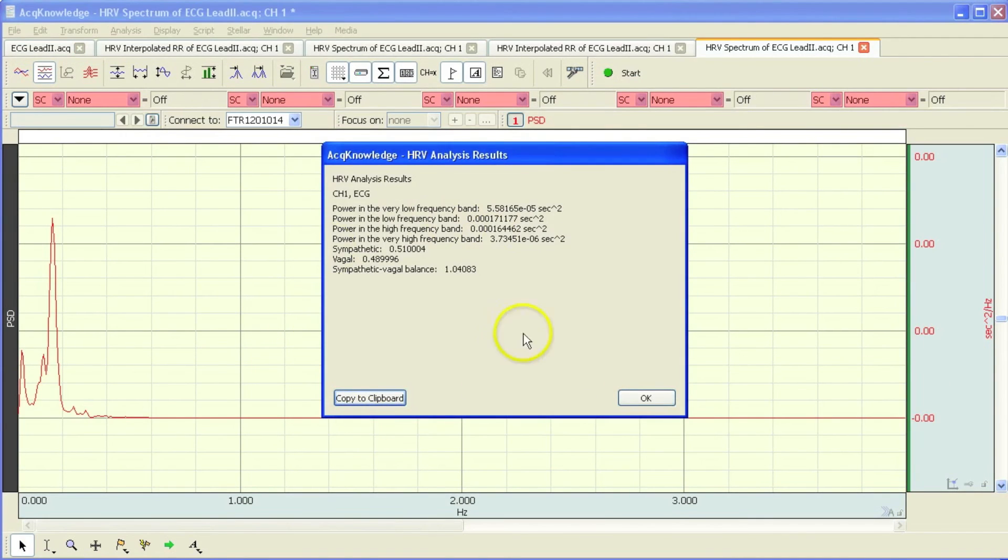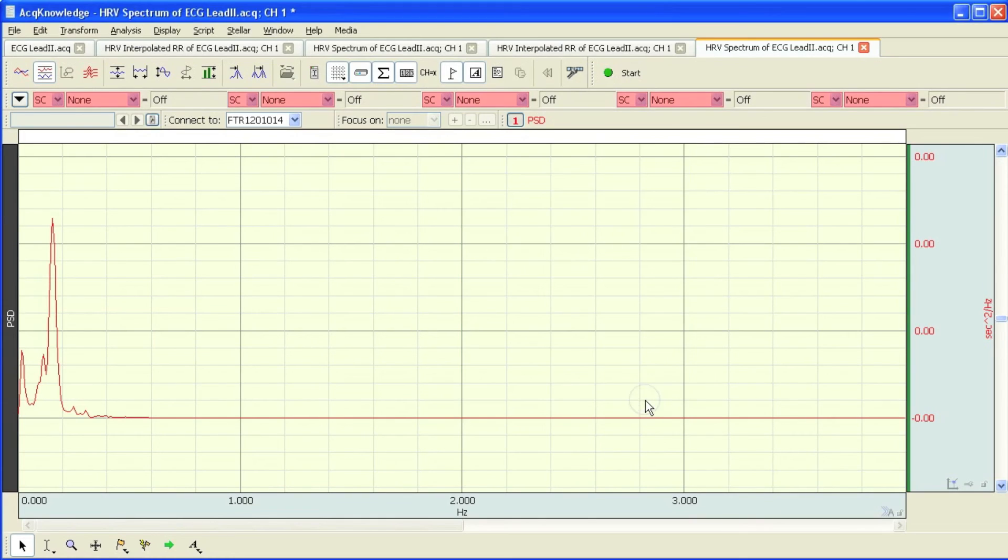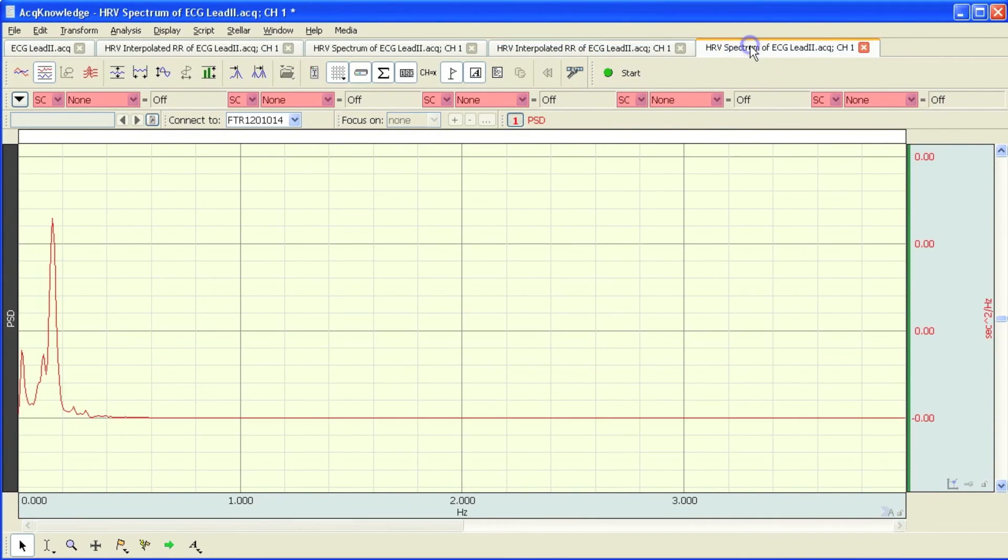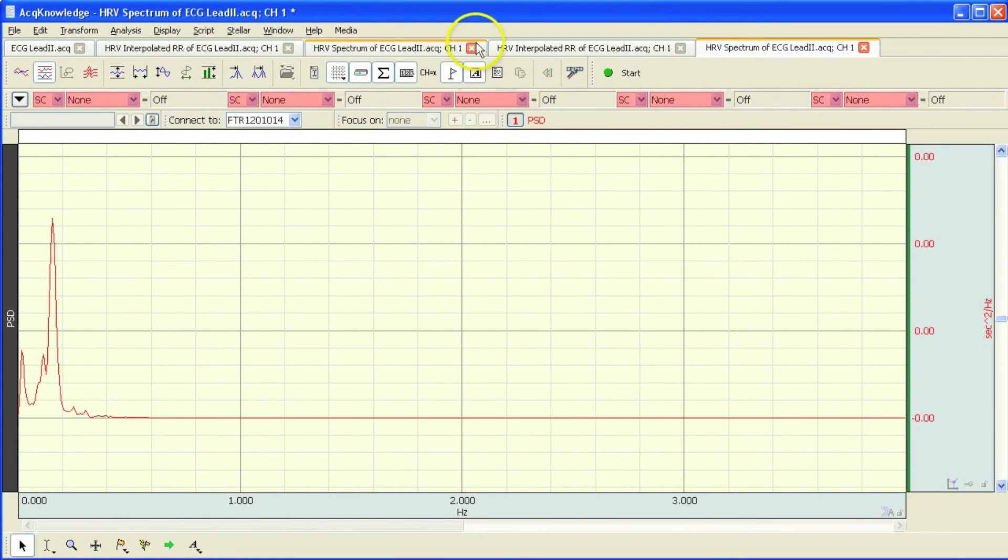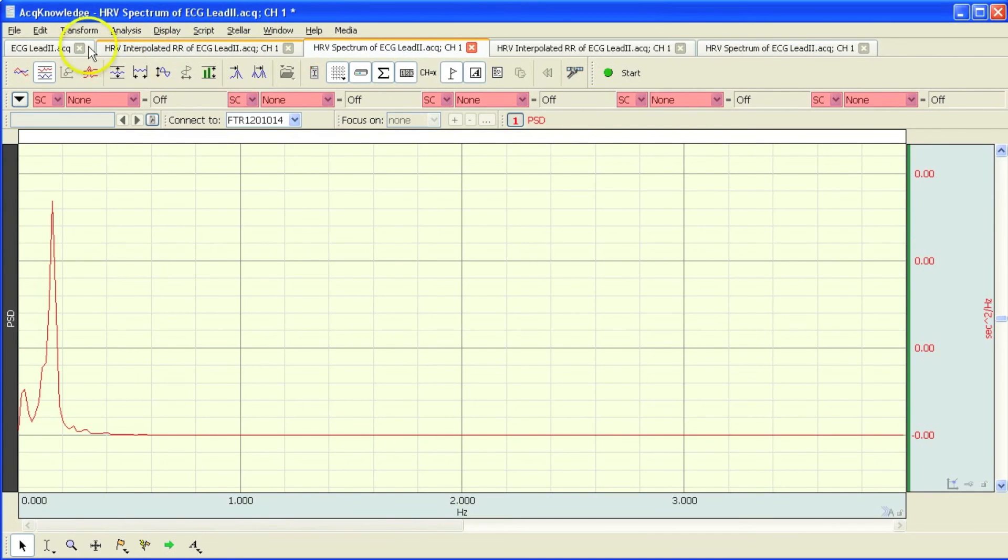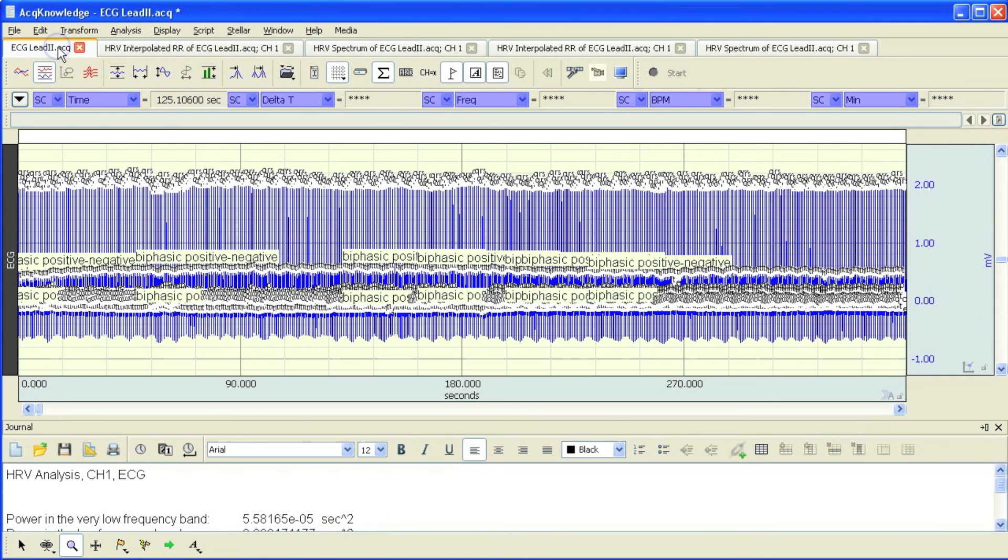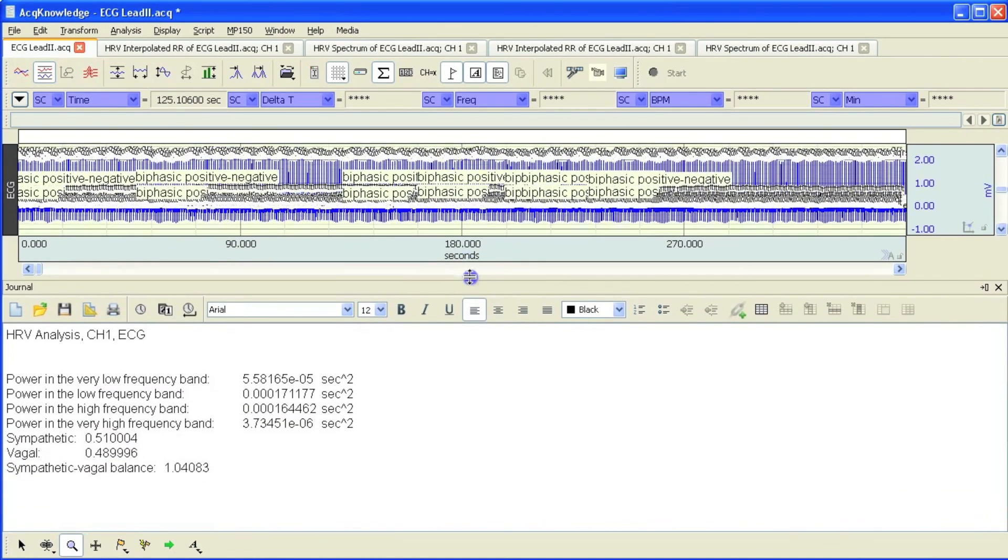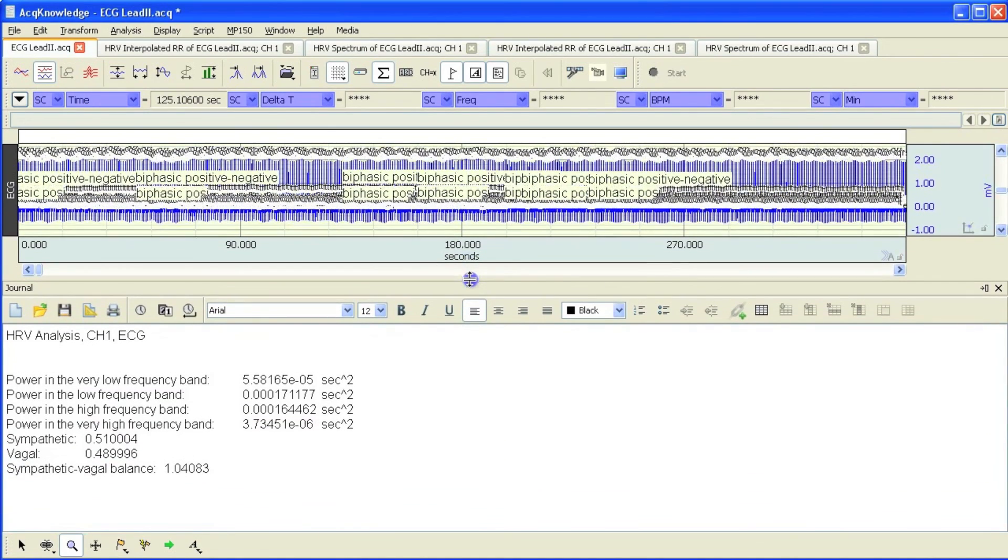So this time we've performed the analysis over the entire file. There's my tachogram. There's my PSD graph. And then if we come back to our raw data again, there we have the results pasted down below.